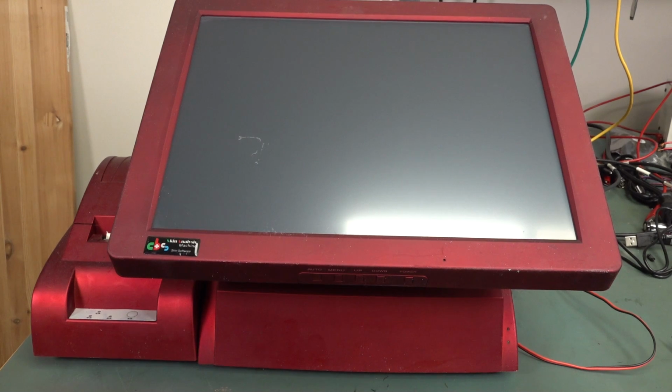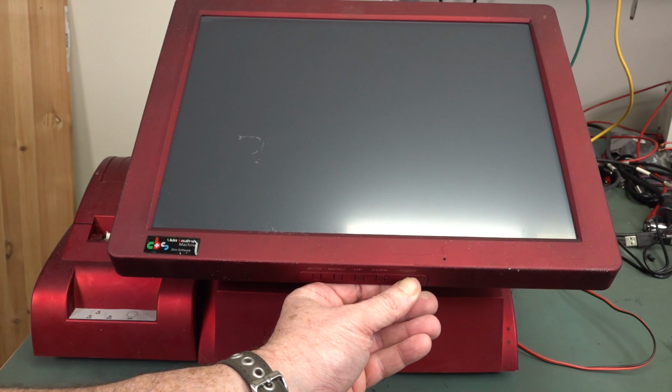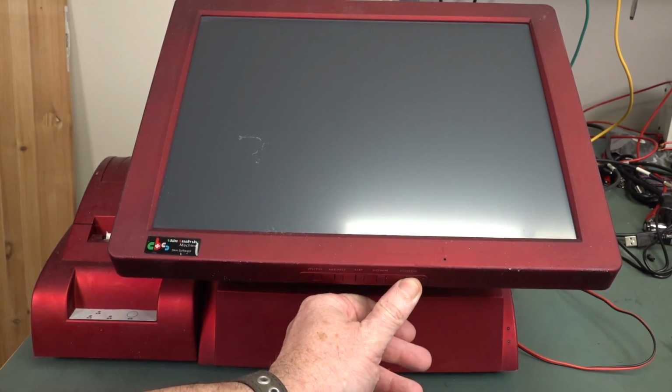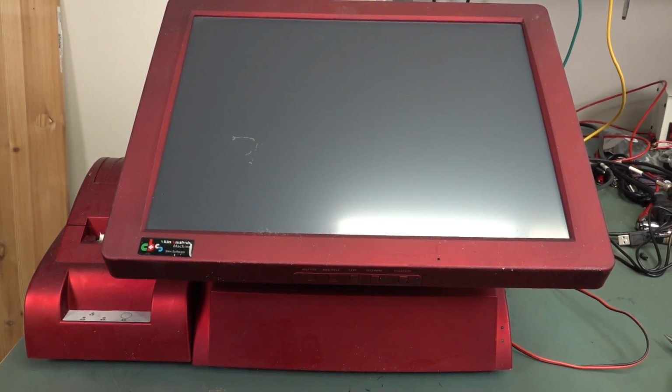So let's hit that. Hold it down, maybe. No, I'm seeing no change in current. Nothing. Zippity-doo-dah. I couldn't be bothered going to the effort to find another plug to wire them all in parallel or whatever. Meh. Let's just crack it open.